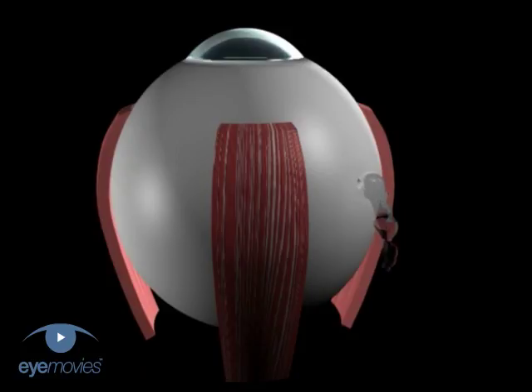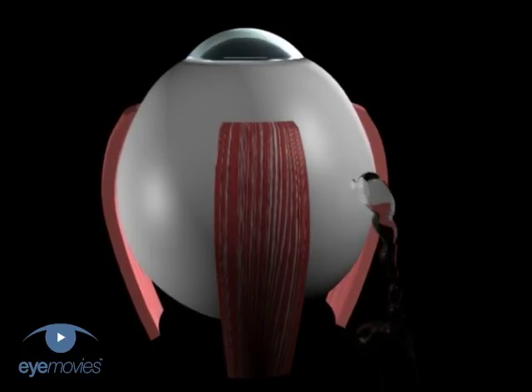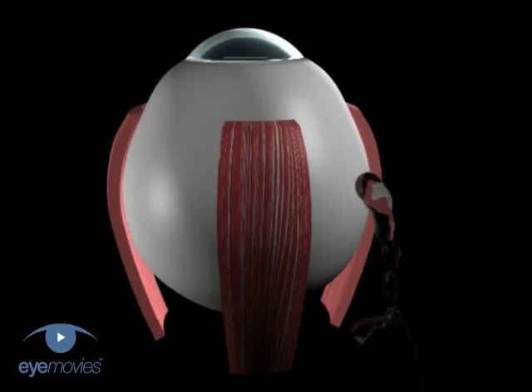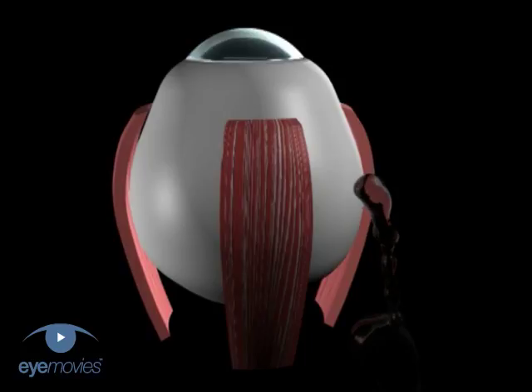If there is a bullous retinal detachment, subretinal fluid drainage may be followed by collapse of the eye. The profound resulting hypotony puts the eye at risk of severe intraocular bleeding and pupil miosis. If the eye starts to go very soft, you should avoid further manipulation and reform the globe.